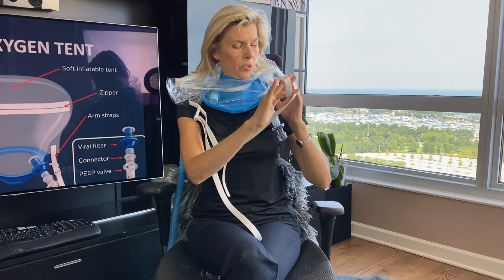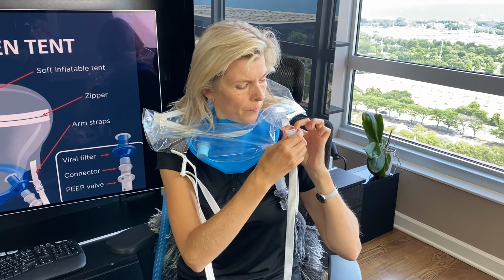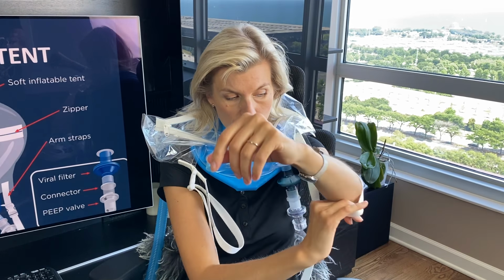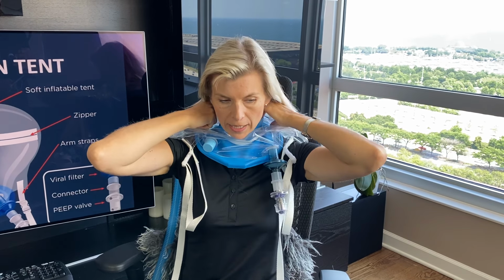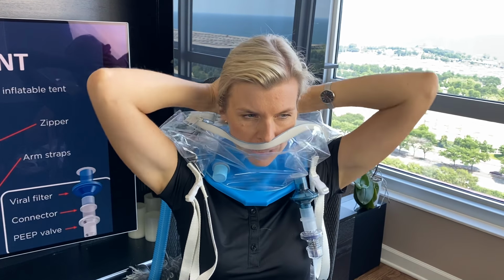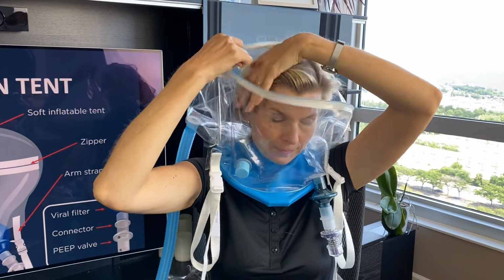You have your arm straps ready to adjust. It's easy to adjust. It's like easy snap on, snap off clips. And it is very important that you have it ready for the patient, and I will show you in a minute why. So when everything is comfortable and you have your gases flowing and the patient is ready, definitely make sure that there is no hair in the way, nothing that can obstruct the view.